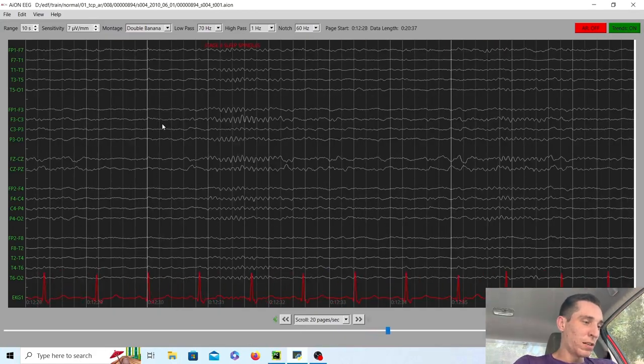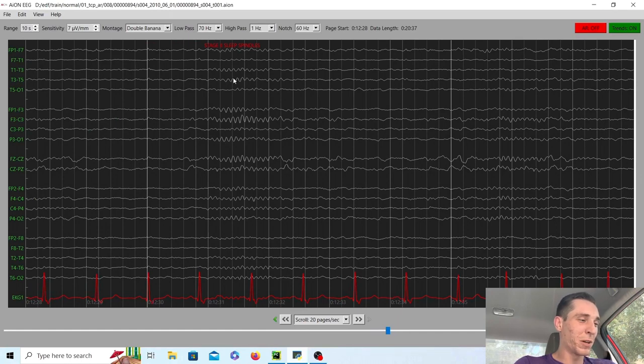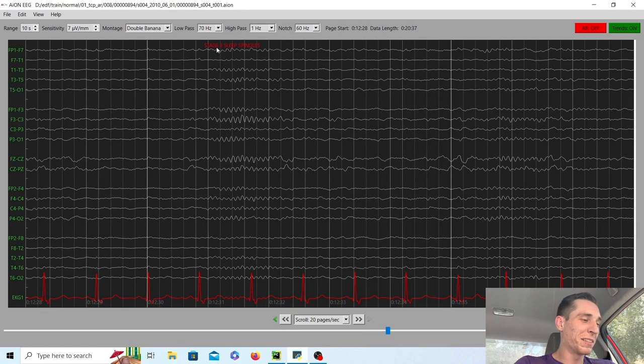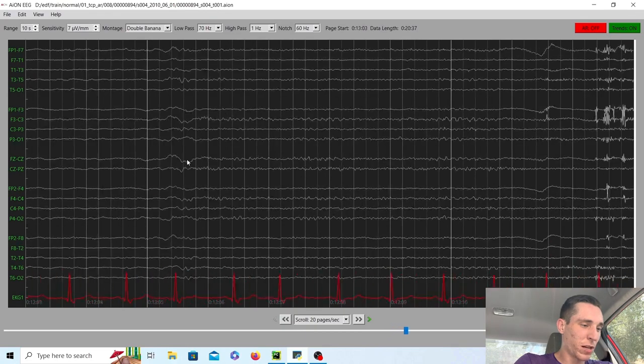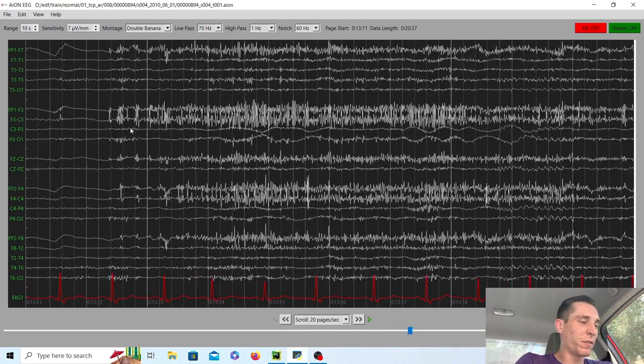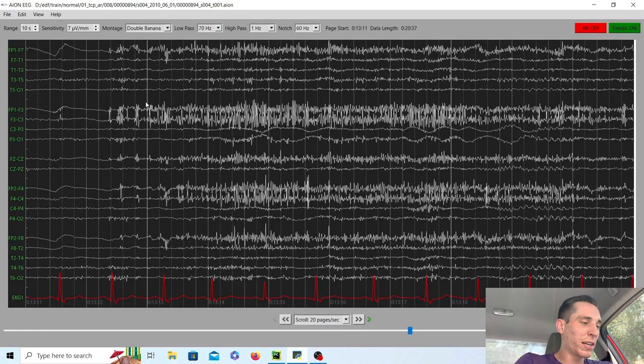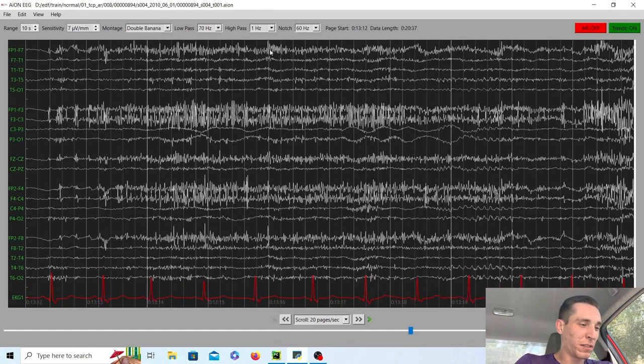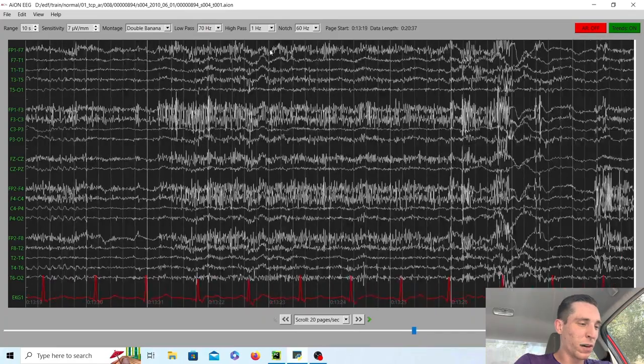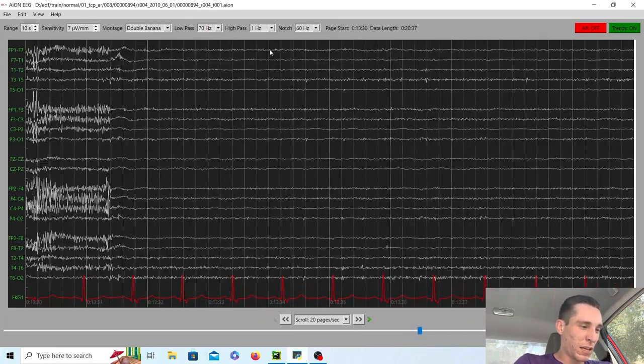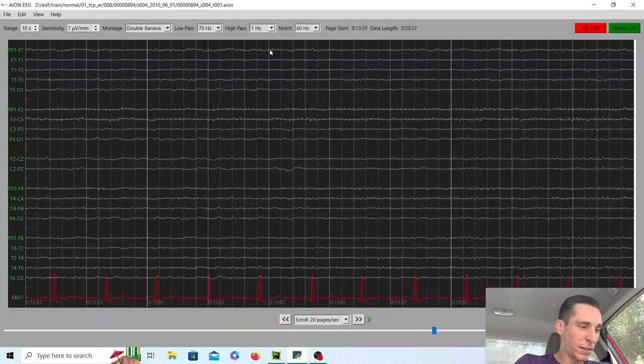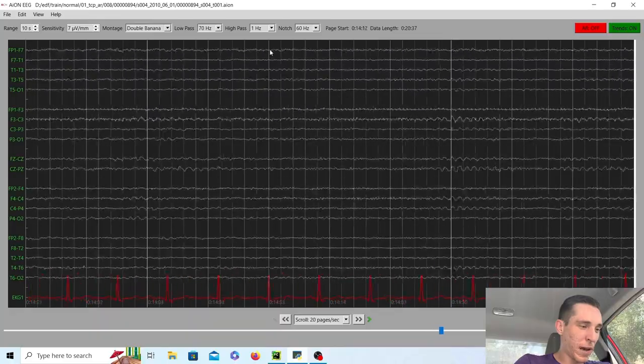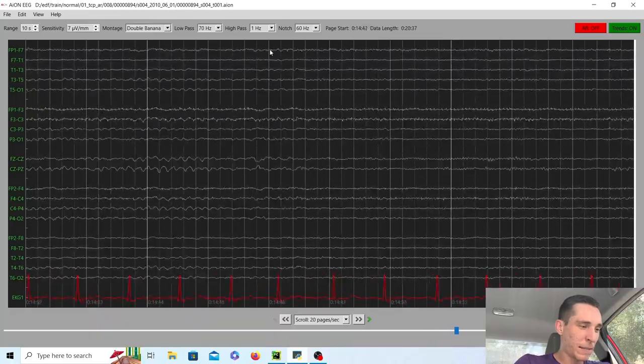I made good little annotations for you guys. So hopefully that'll help as well along with the commentary. As we scroll on, we got a little bit of an arousal right here. You can tell from the muscle artifact and a little bit of movement of the eyes. Definitely some sort of an arousal here. And I go back to being eyes closed, relaxed.